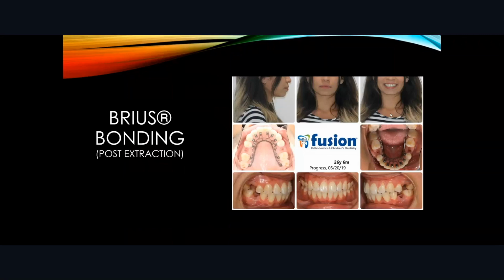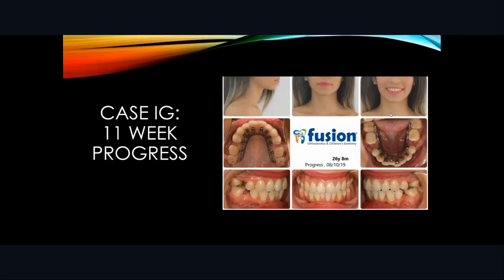She had already removed the teeth because that premolar was painful. The patient was bonded in May of 2019. And then she came back in August, and we noticed that the spaces on the top are halfway closed, the bottom is a little bit slower, but still closing.